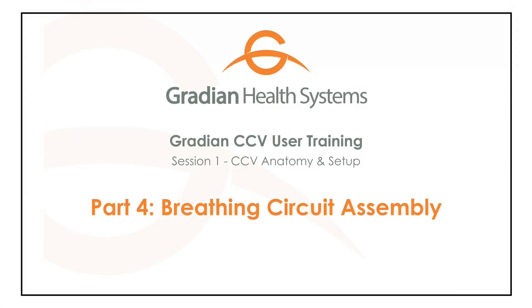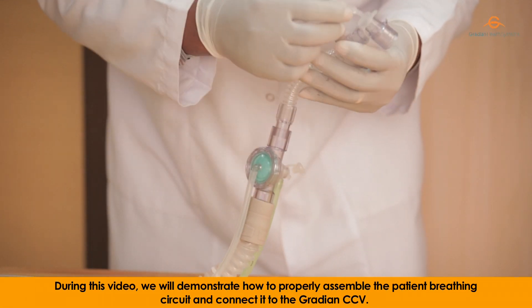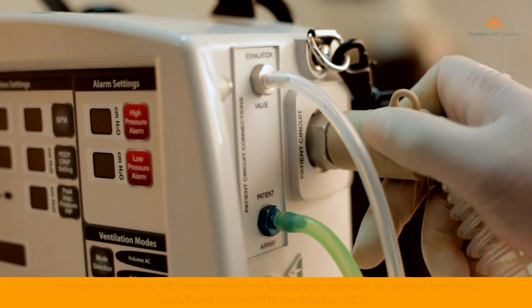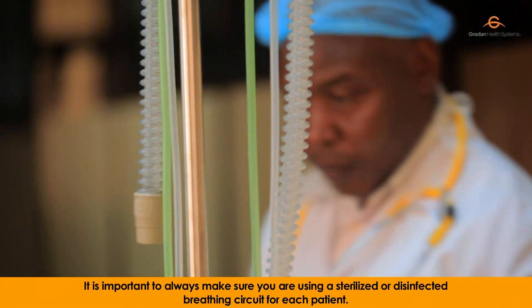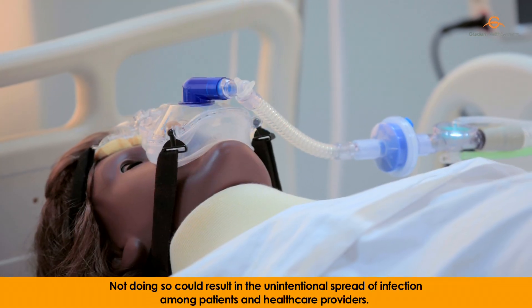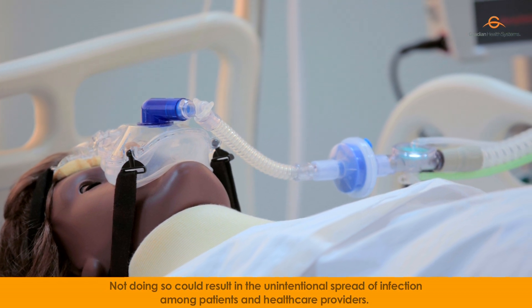Breathing circuit assembly. During this video, we will demonstrate how to properly assemble the patient breathing circuit and connect it to the Gradian CCV. It is important to always make sure you're using a sterilized or disinfected breathing circuit for each patient. Not doing so could result in the unintentional spread of infection among patients and healthcare providers.